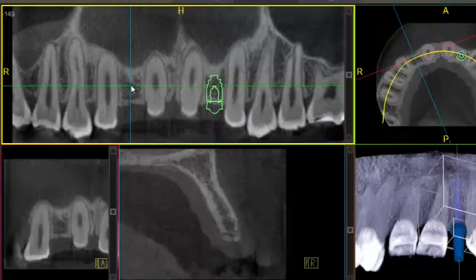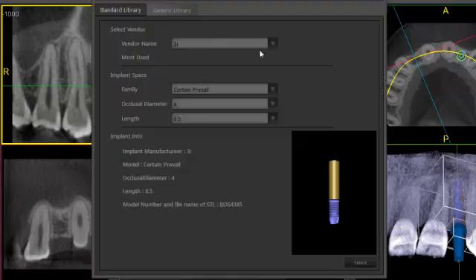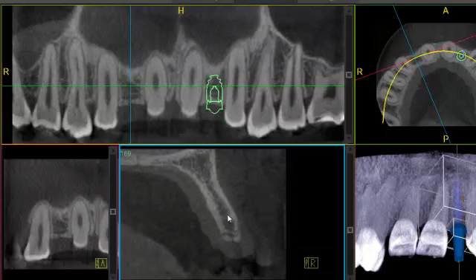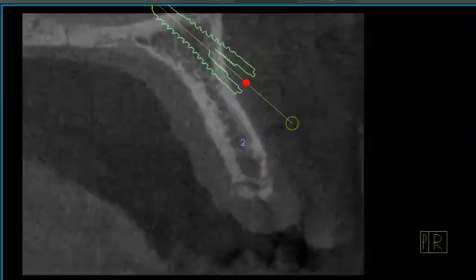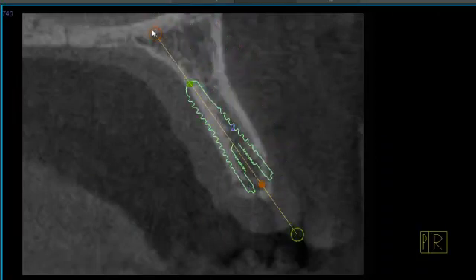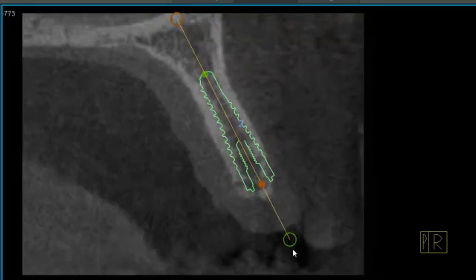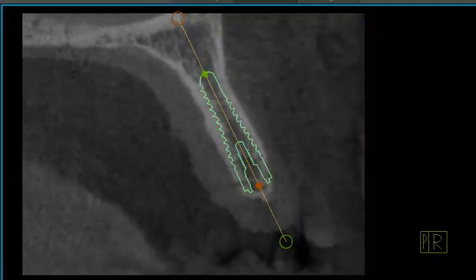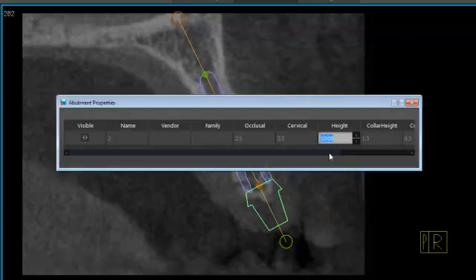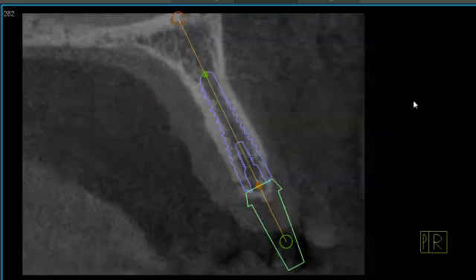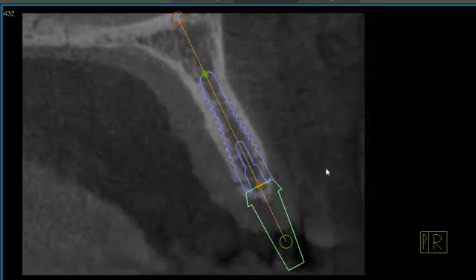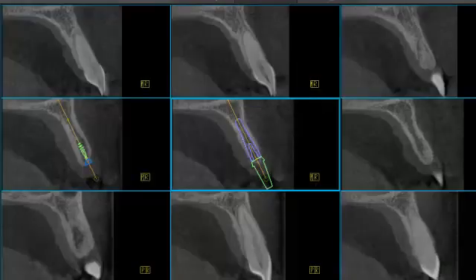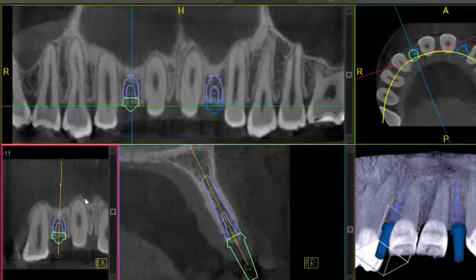Now I will come over here and click on the number 7 spot, go back to my library, and once again start here in the cross section. I will go ahead and throw our abutment on and give this one just a little bit of angle. Just to show you real quick here in your cross section, we have a single slice, a three slice, and also a nine slice. Now we can go back over to our transaxial view.